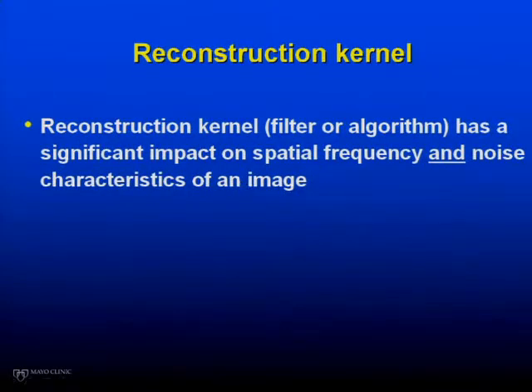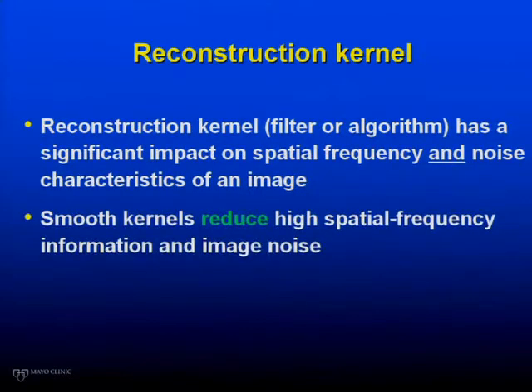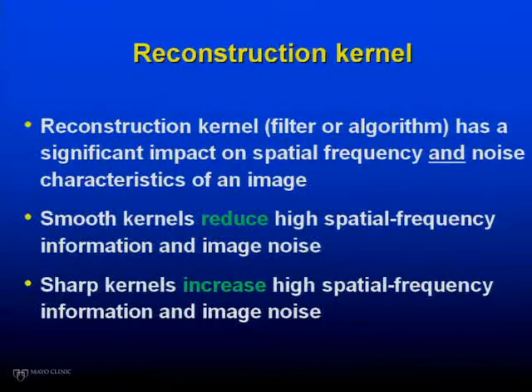Reconstruction kernel. Some manufacturers call the reconstruction kernel a filter or algorithm. It has a significant impact on the spatial frequency and noise characteristics of the image. A smooth kernel reduces high spatial frequency information and image noise. A sharper kernel increases high spatial frequency information and image noise.